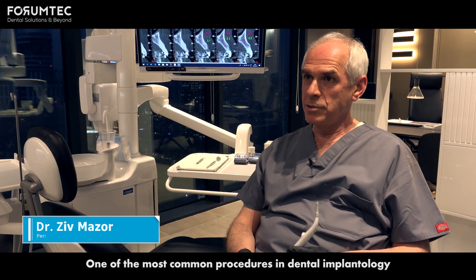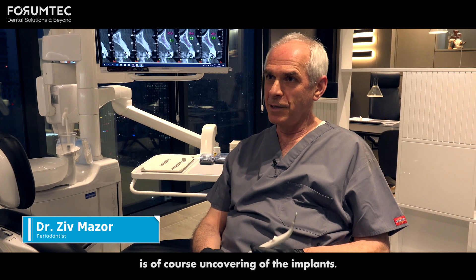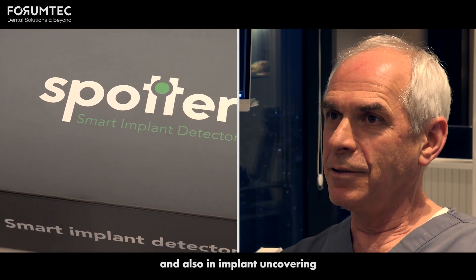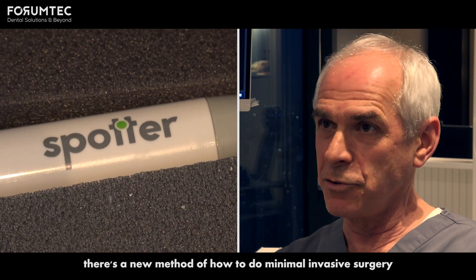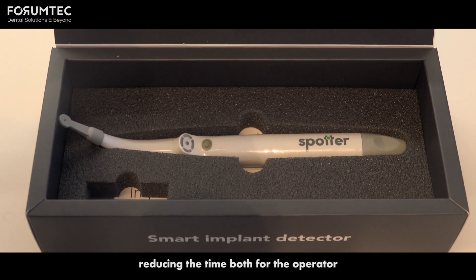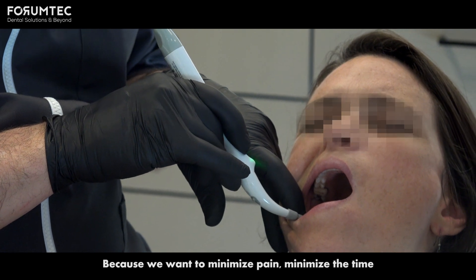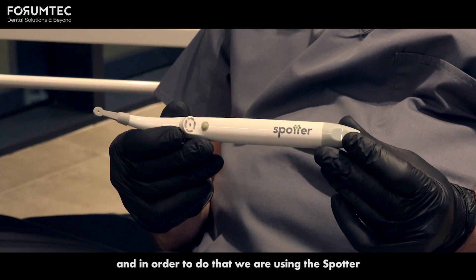One of the most common procedures in dental implantology is uncovering of the implants. Everything is moving toward minimal invasive surgery, and also in implant uncovering there is a new method of how to do minimal invasive surgery — reducing the time for the operator and reducing post-op discomfort for patients. We want to minimize pain and minimize the time.